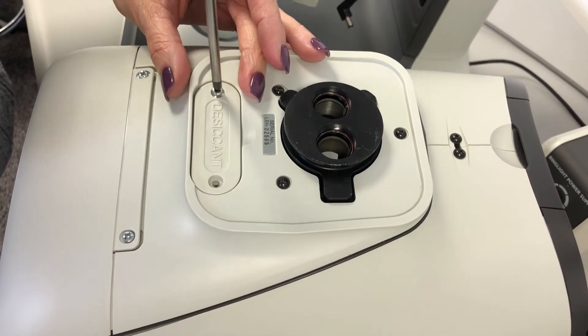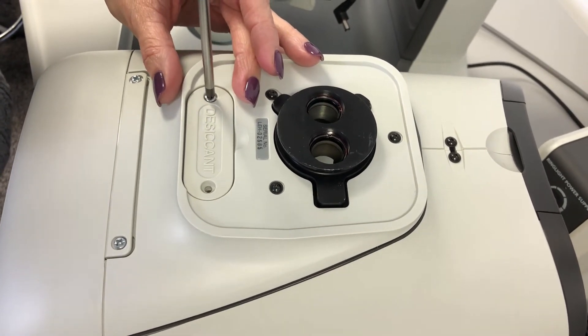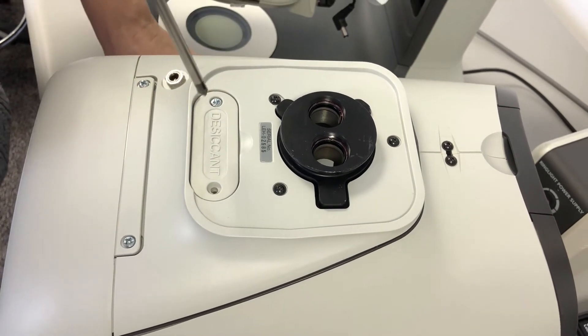Reinstall the screws, being careful not to over tighten them.